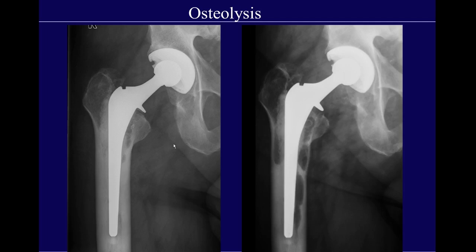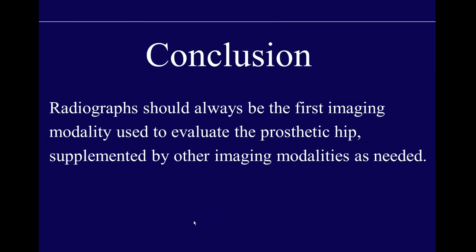This brings up the concept of the effective joint space — any site reachable by joint fluid, not just the bearing surface itself. Therefore osteolysis can occur at any sites away from the actual articulating surfaces. In this patient in January 2006 with a cemented metal-on-polyethylene stem, two years later there are large areas of osteolysis clearly remote from the bearing surface. Just by walking, joint fluid containing histiocytically upregulated osteoclasts eats away at the cement and native femur. In conclusion, radiographs should always be the first imaging modality to evaluate the prosthetic hip, supplemented by other modalities as needed.